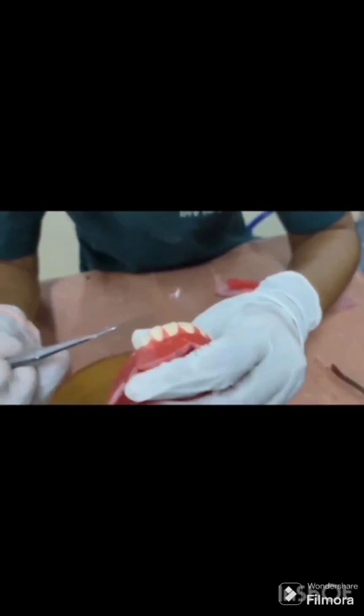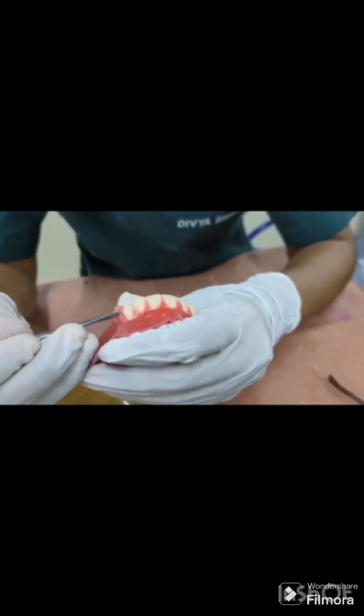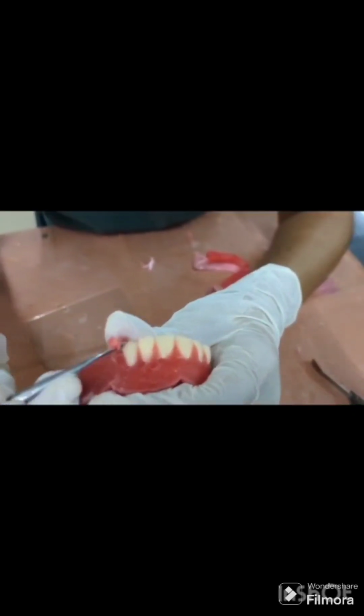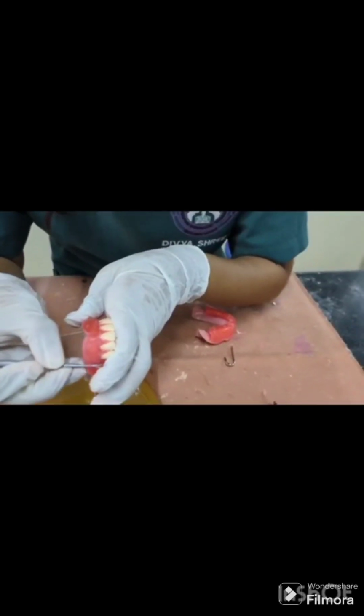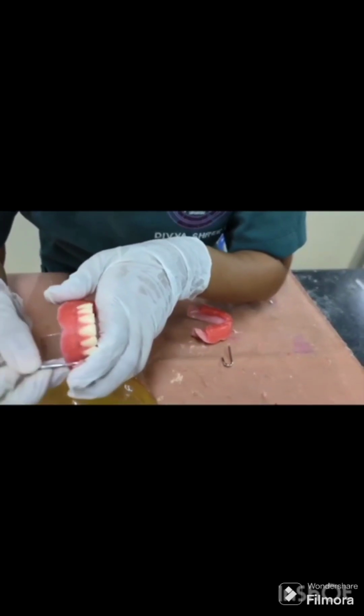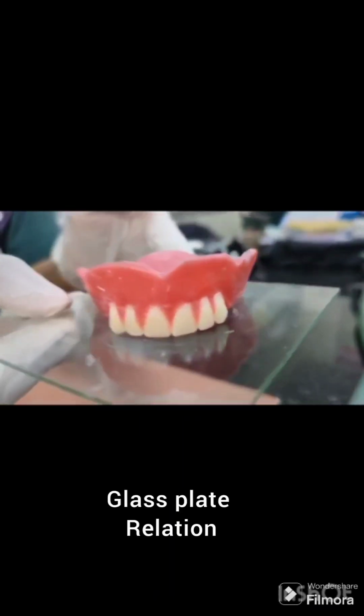The tip of the canine contacts the occlusal plane. When viewed from the front, only the mesial slope of the canine is visible. Now we have to frequently check the glass plate relationship after the arrangement of the maxillary central, lateral and canine.